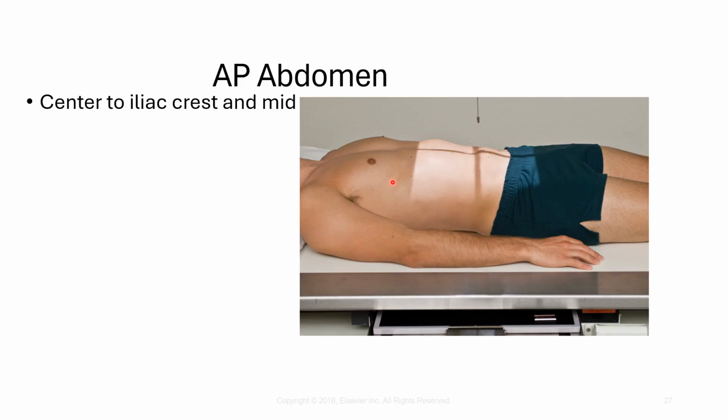On this particular image, they are telling you that with this patient, you could do 1 IR placed portrait to the patient, and according to the book, the only required anatomy is an outline of the liver, the spleen, the kidneys, the psoas muscles, the stomach and bowel segments, and the arch of the pubic symphysis for the urinary bladder region. It does not require the diaphragm.